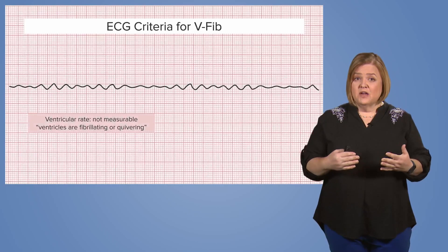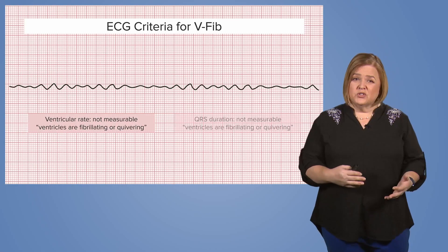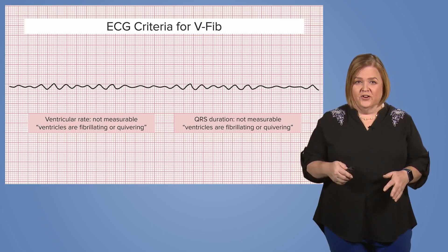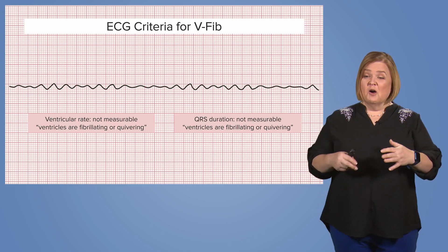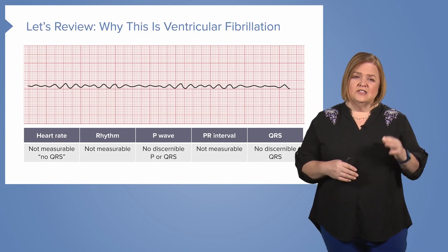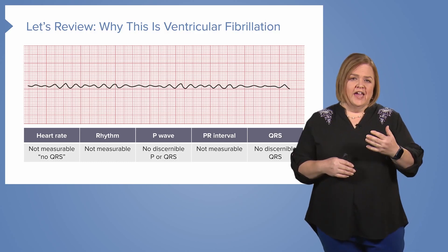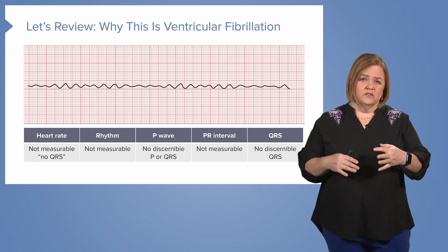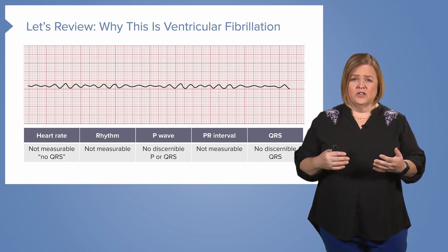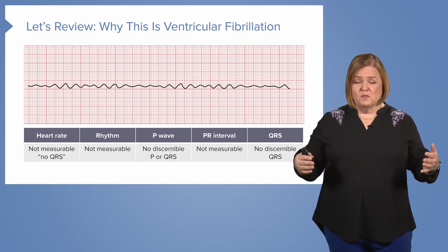You cannot measure the ventricular rate because the ventricles are fibrillating or quivering. Can't measure the QRS because the ventricles are fibrillating or quivering. So when we review why this is ventricular fibrillation, it's not measurable because there's no QRS as far as heart rate. We can't identify a regular rhythm because it's fibrillating. The P wave isn't there, and we don't have a QRS, so we can't do the PR — none of these are appropriate.